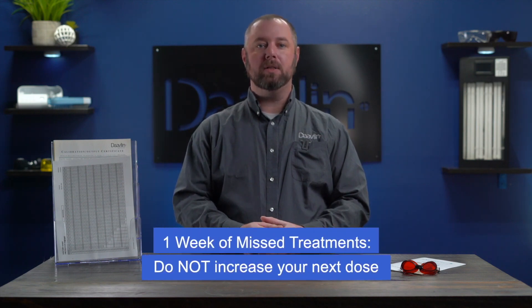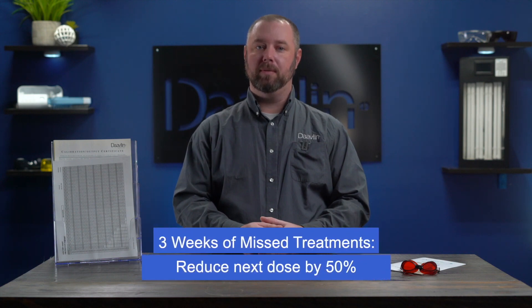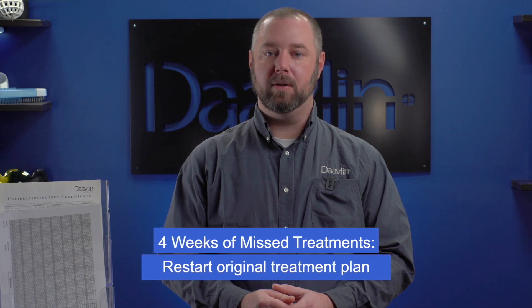So what should you do if a treatment is missed? We get it — sometimes life gets in the way. Just keep in mind that if you missed any treatments, you might need to adjust your next treatment. If you've missed a week of treatments, do not increase your next dose; instead, use the same dose that you used for your last treatment. If you missed two weeks of treatments, reduce your next dose by 25 percent. If you missed three weeks of treatment, reduce your next dose by 50 percent. But if you've missed four weeks of treatment, you'll need to restart your entire course of treatment, beginning again with your starting dose.